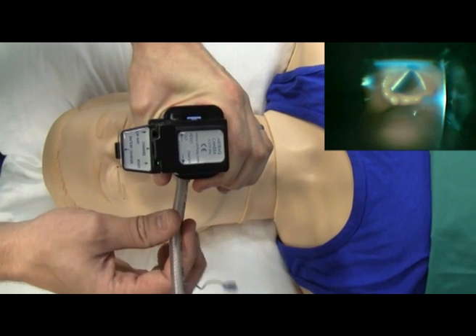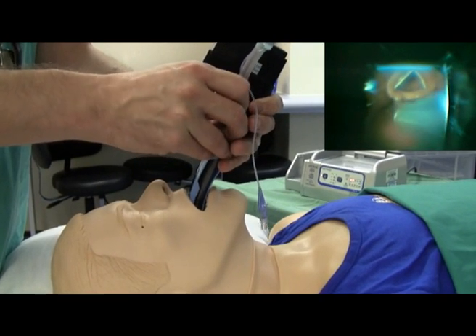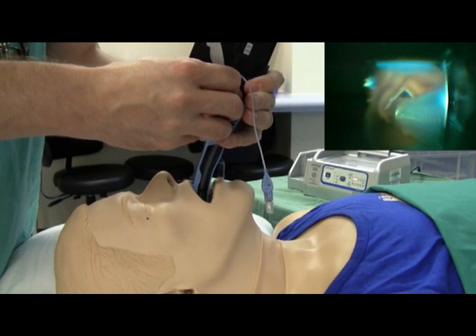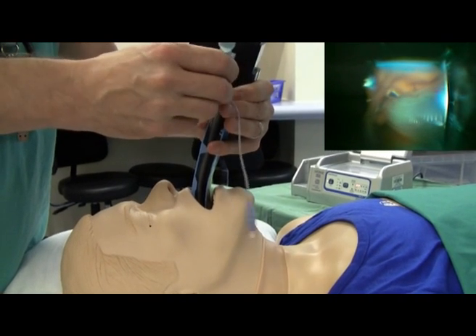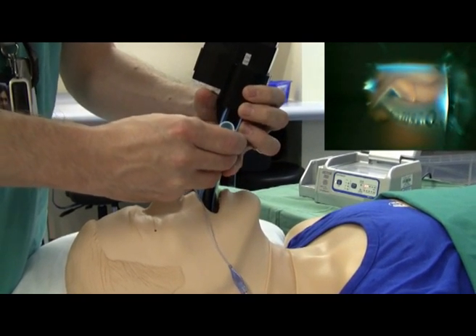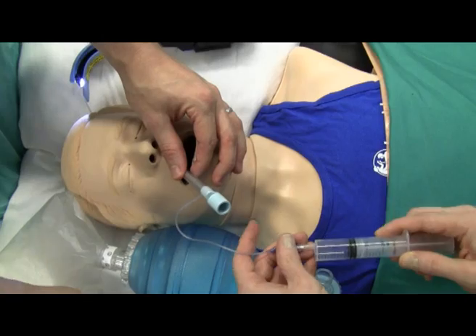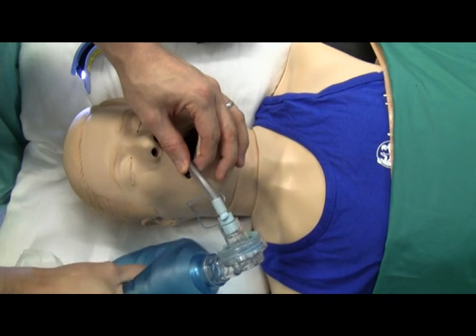With your right hand, grab the preloaded endotracheal tube and advance it. If the tube is not going in, what you need to do is lift the Airtrack. You may also have to twist the laryngoscope to bring the tube in line with the glottis. Advance the tube into the trachea and carefully peel the tube out from the channel. Remove your Airtrack, inflate the cuff, attach your ambu bag, and confirm that you can ventilate the mannequin's lungs.